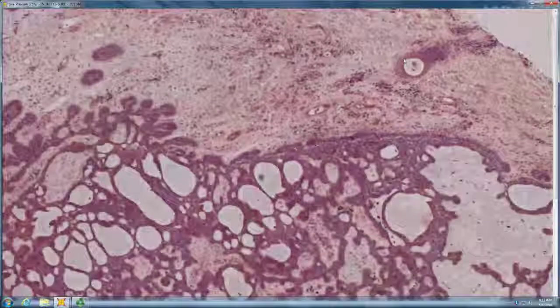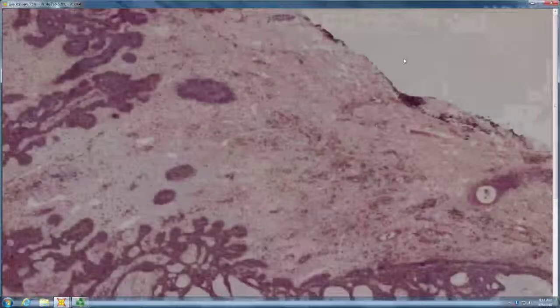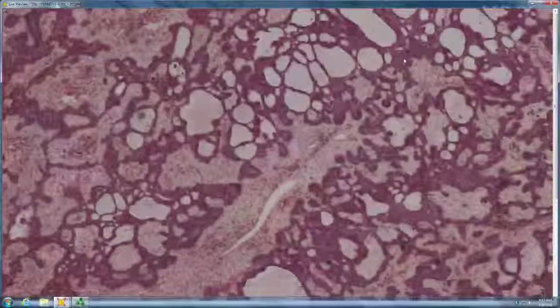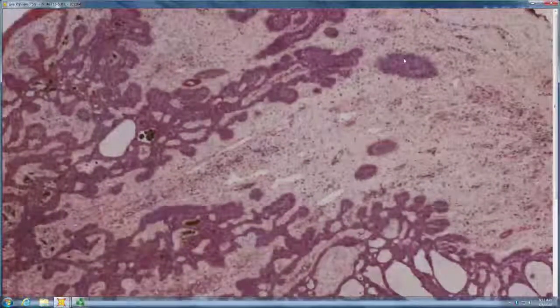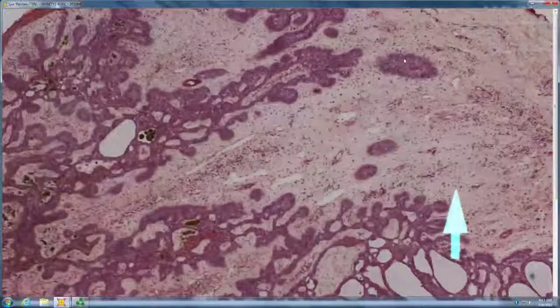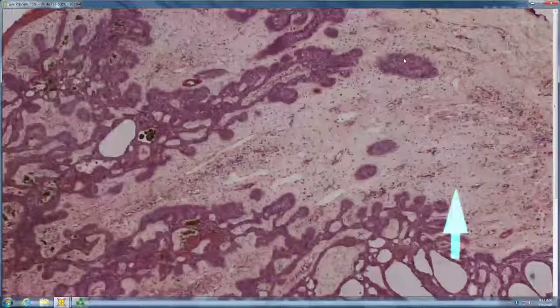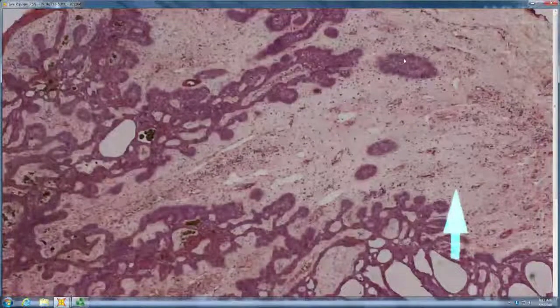It's pigmented. Trichoepithelioma. So it's pigmented. Does it have a pilar stroma? Not really. So does it have a fibroblast-rich concentric stroma? No, it's more fibromyxoid maybe.